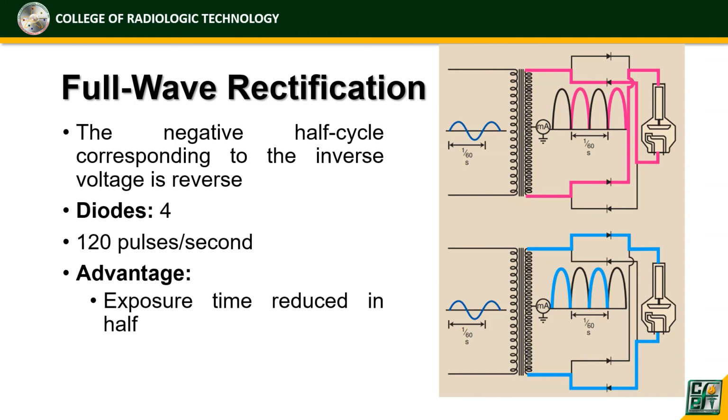So again, ordinarily we have the voltage waveform na ganito, di ba? Then kapag half wave rectification, nagiging siyang ganyan.